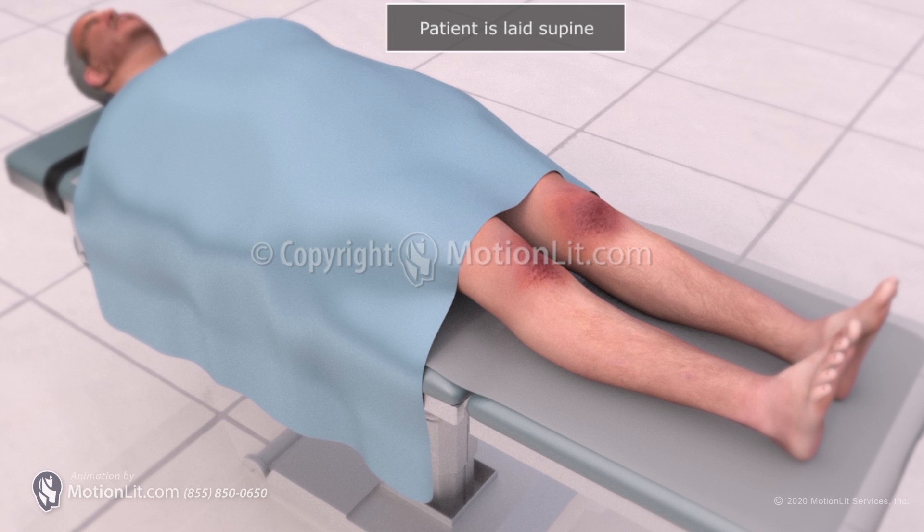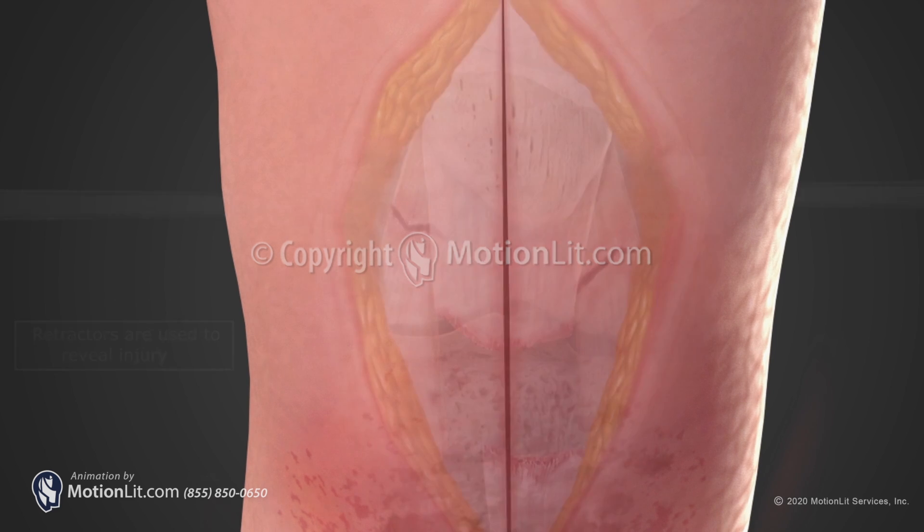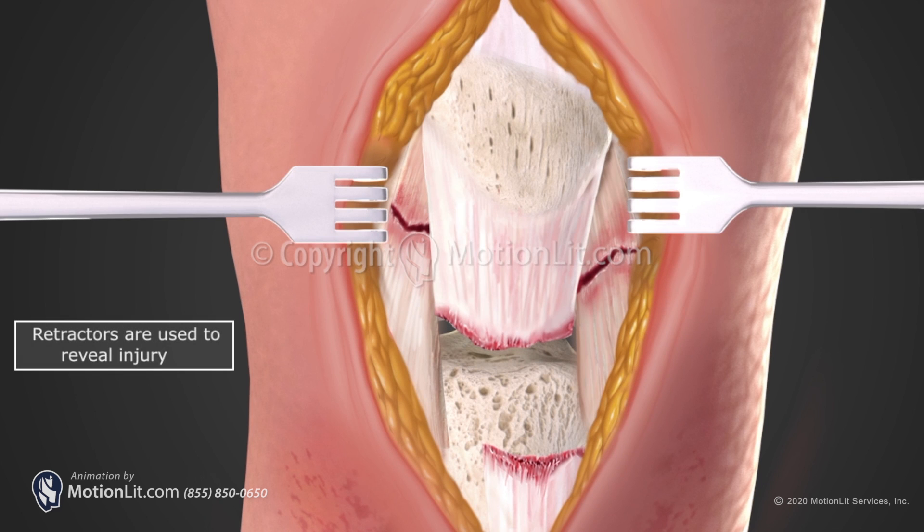The patient is brought into the operating room and laid supine on the back. Using a blade, a midline incision is created centered over the patella down to the tibial tuberosity. Retractors are placed and dissection is continued down.